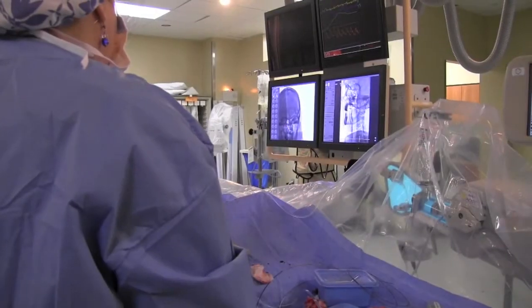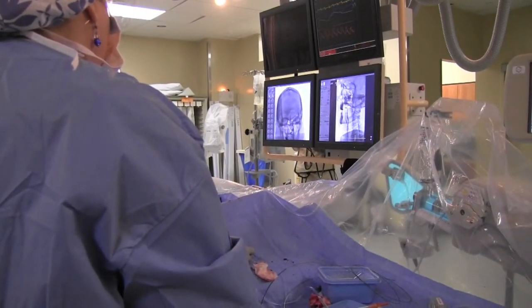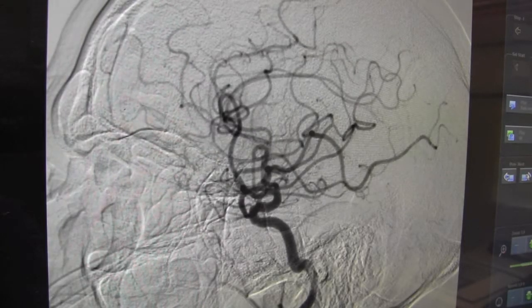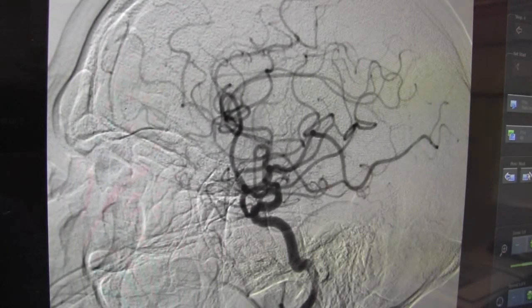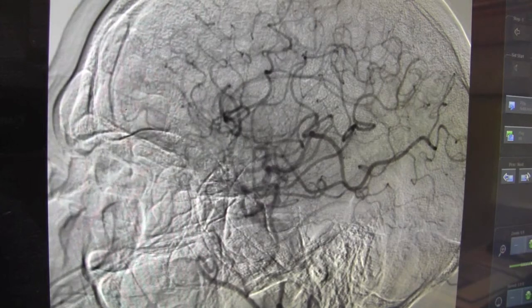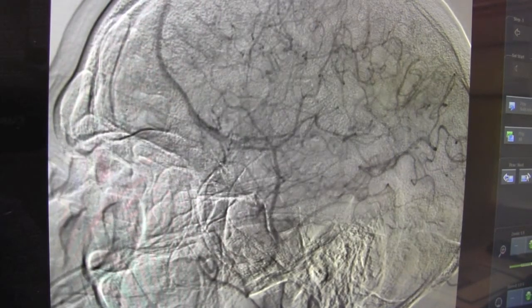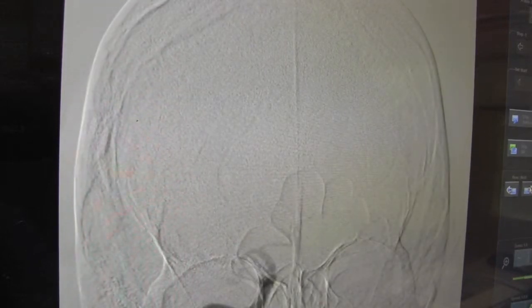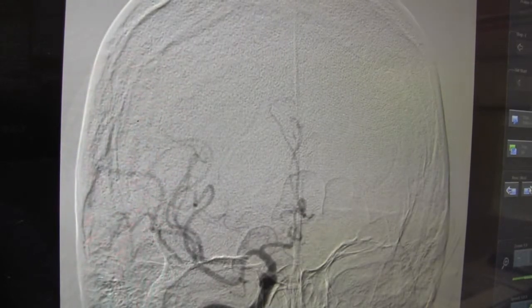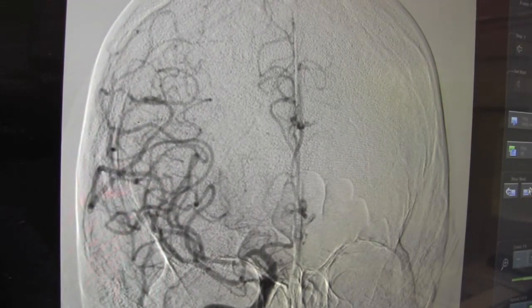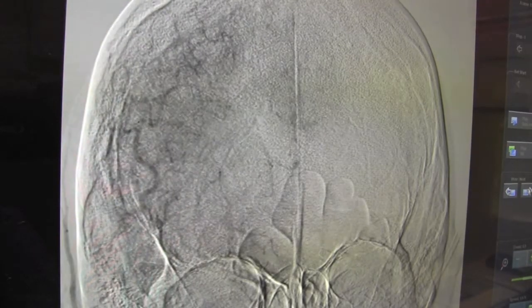At the end of the procedure we always perform a cerebral angiogram. These are the cerebral arteries which feed the brain — we do this just to make sure no plaque debris has gone upstream and clogged any of these small arteries. We want to confirm that no plaque has broken off and blocked any of the small branch arteries up in the brain.